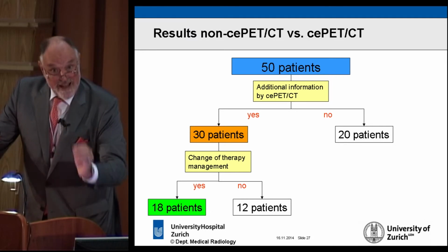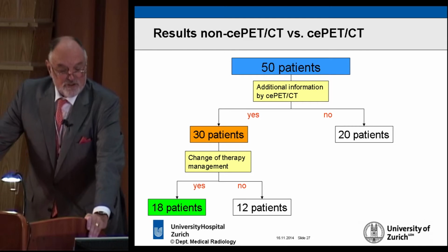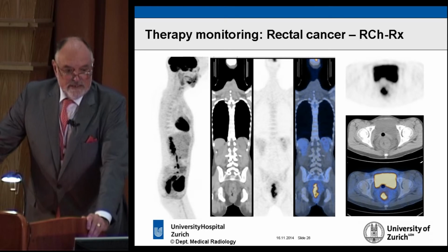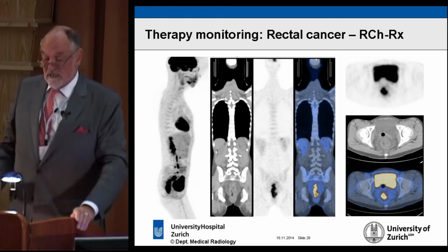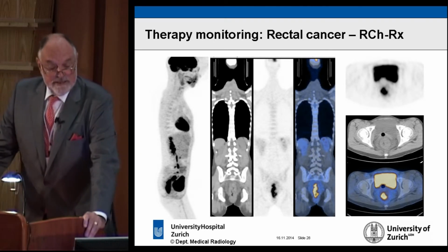In some major tumors, there is prognostic quality to FDG PET. There are other tracers, but FDG PET. And I show you some data here from an Australian group. What you see here is a patient with a rectal cancer, and this patient gets treated, and after treatment, the patient has not improved. In fact, you can see that the patient has some liver metastasis which grew under therapy.